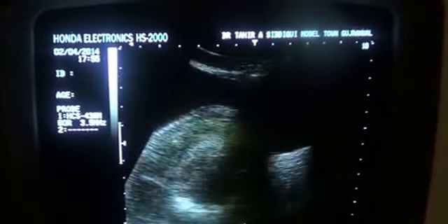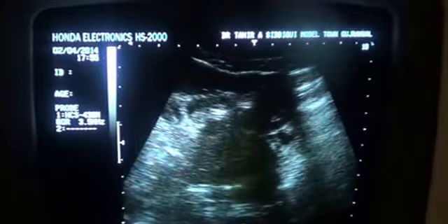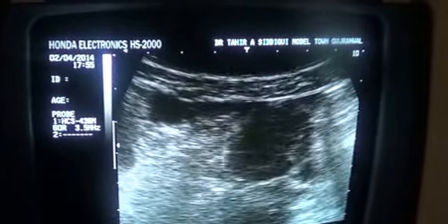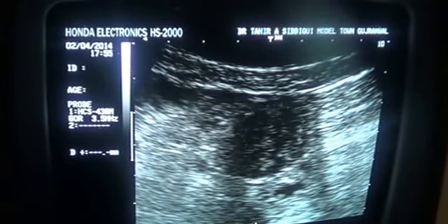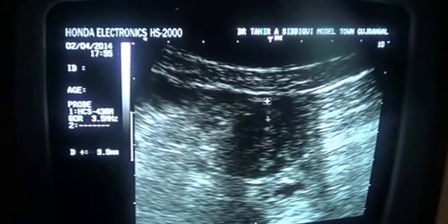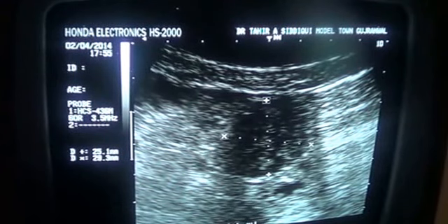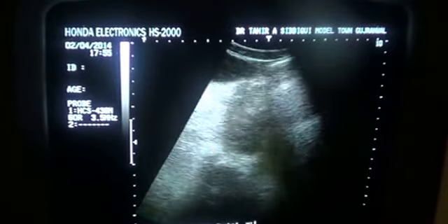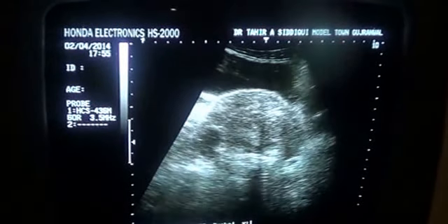The second one is now left over. This one. There is another one, this. Now this is the second one in view. This is the second one, full of echoes, measuring 25 by 29 millimeters. Bilateral retention ovarian cysts. This is the right side that we are seeing.